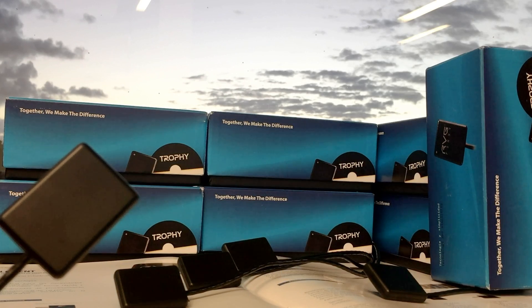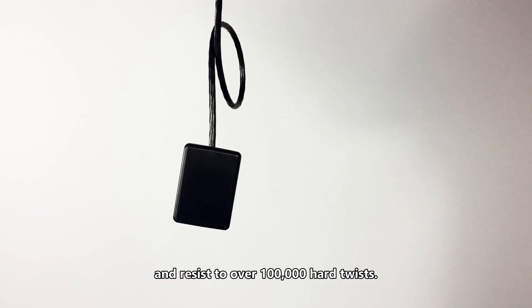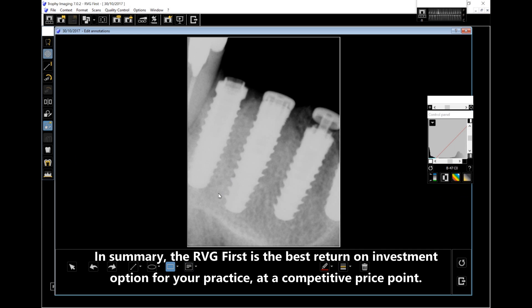Reliable hardware designed to stand high duty over a decade — its cable can hold up to 15 pounds and resist over 100,000 hard twists. In summary, the RVG First is the best return on investment option for your practice at a competitive price point.